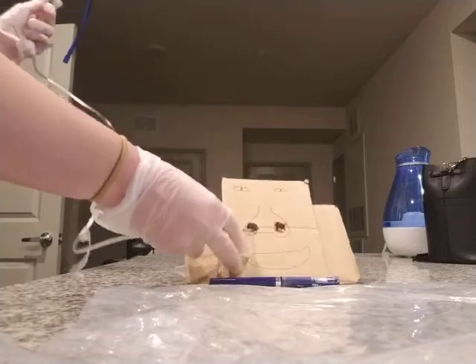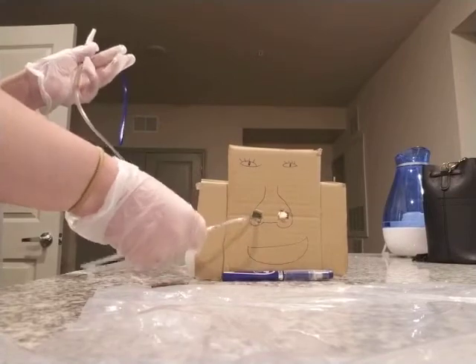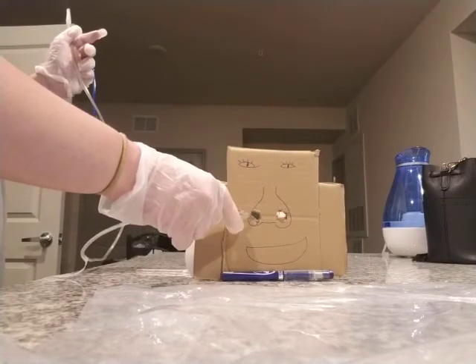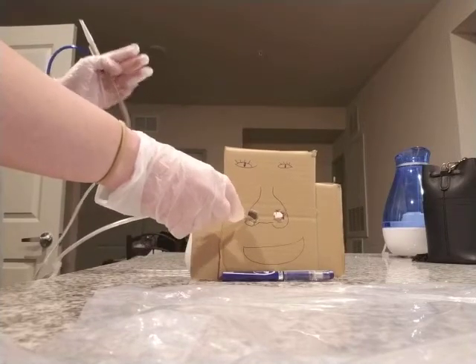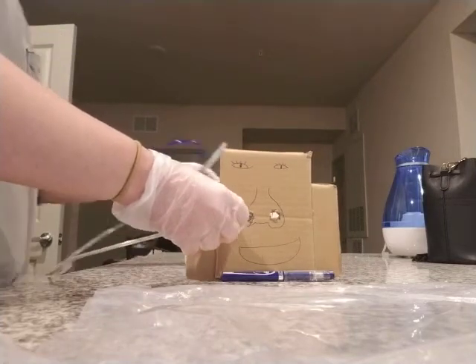I'm going to ask the client to bend their head forward. She can't do that. Chin to chest and swallow. Keep swallowing, and then I'm going to advance the tubing with each swallow.